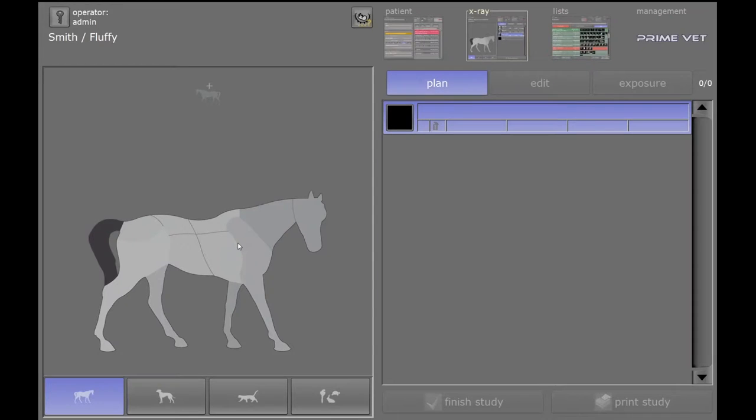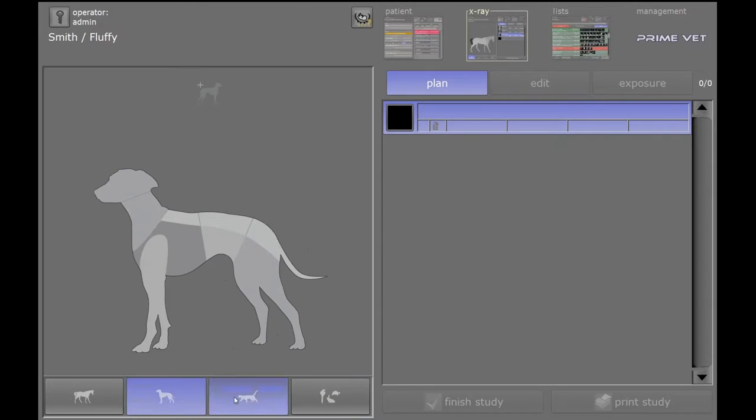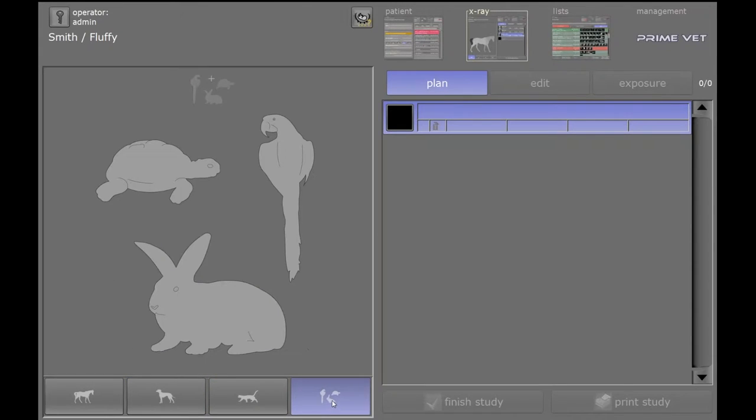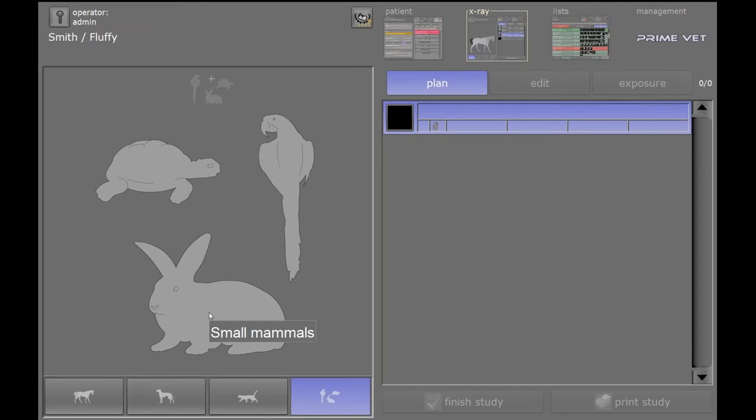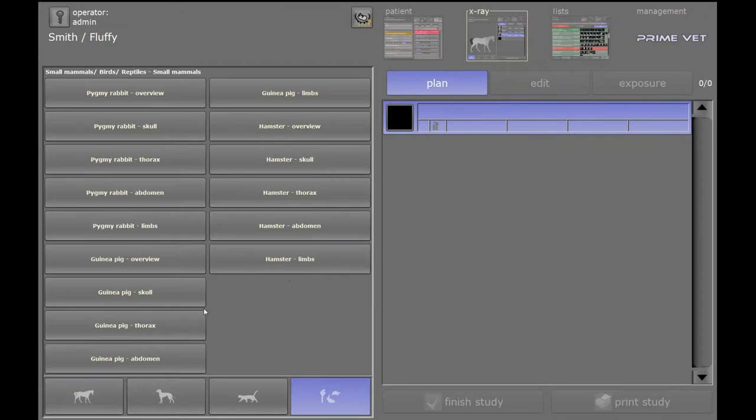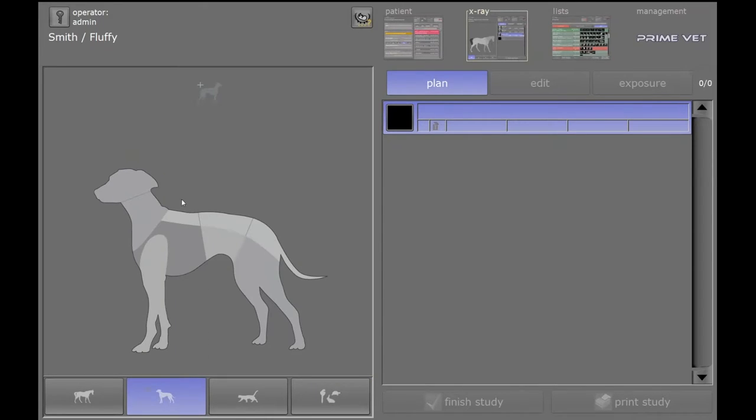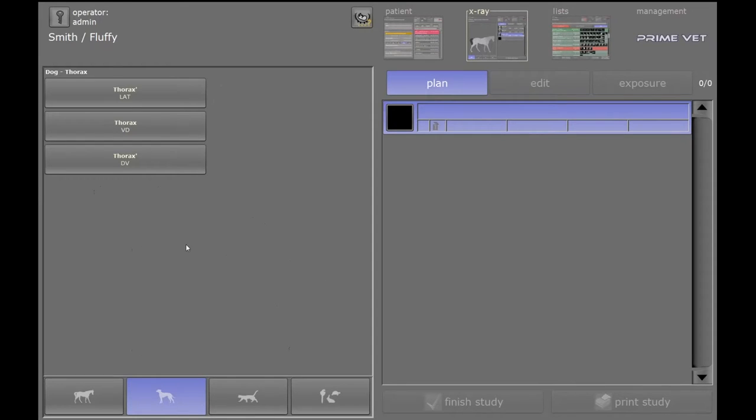Once we're in X-ray mode, you can see the GUI that we have set up for the VET. There are equine, canine, feline, and our exotics and other small animals. There's different views. If you click on the small animal, you can see rabbits, guinea pigs, and whatnot.